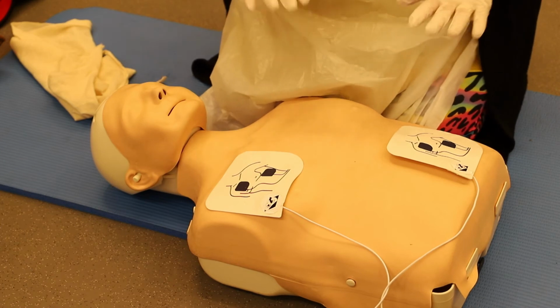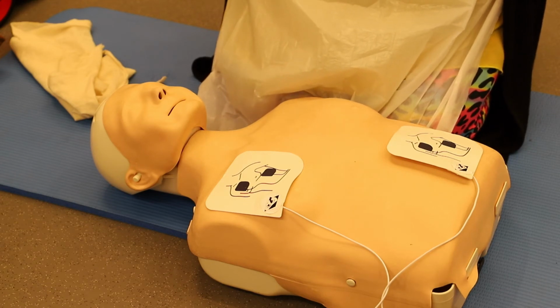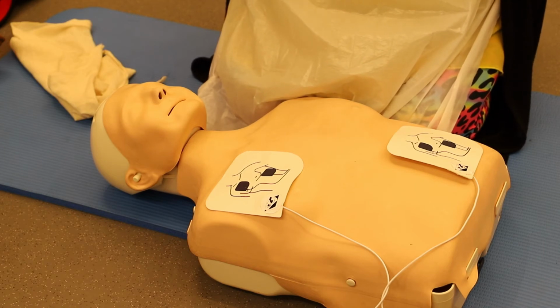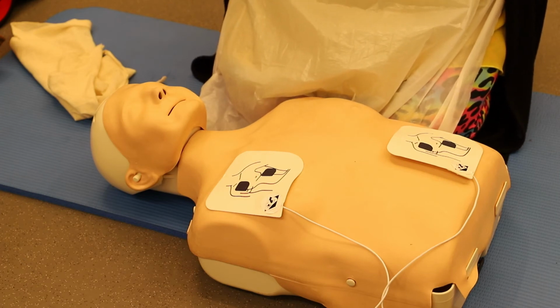After every 2 minutes, the machine will recharge itself and it will analyse the heart rhythm. So when analysing the heart rhythm, it's checking for a heartbeat in your casualty. If it detects a heartbeat, it will tell you not to press the shock button, but to continue with CPR if needed. Okay, you will continue this process until obviously the ambulance people arrive.